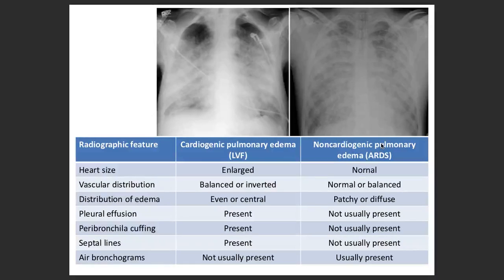One of the important things I really wanted to highlight was cardiogenic pulmonary edema versus non-cardiogenic pulmonary edema, which is called ARDS. It is very important to diagnose that. Why am I talking about this? Because especially if a patient is in the ICU, you will have to differentiate between those two, because when you want to do the prognostication of the patient, or even initiate the treatment or therapy, you should be able to differentiate it.